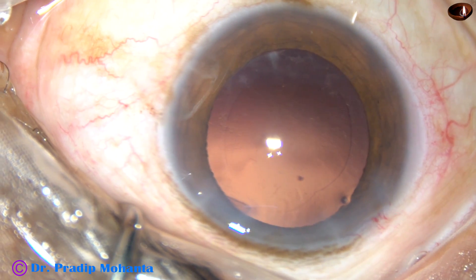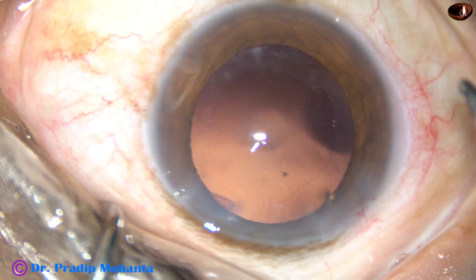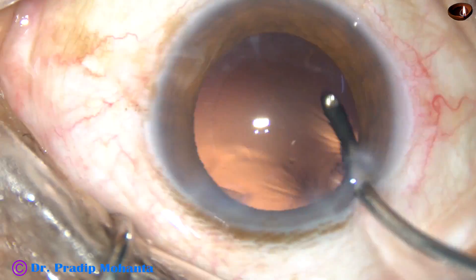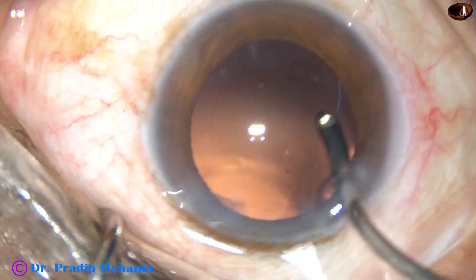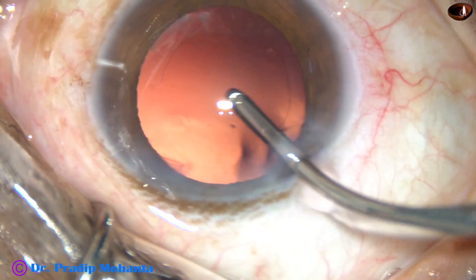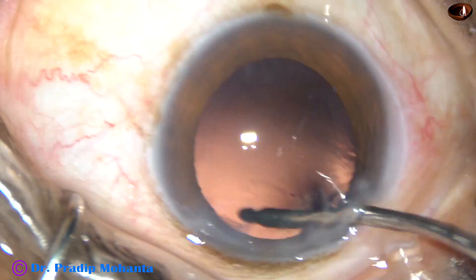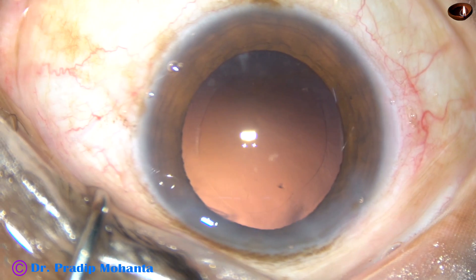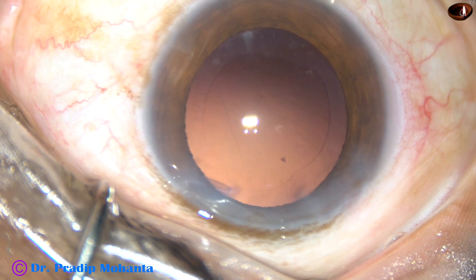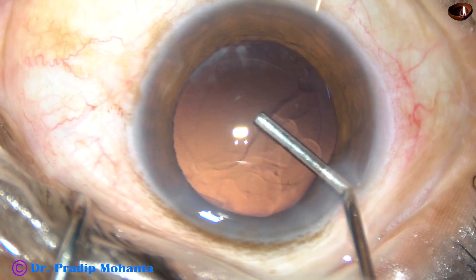A 23-gauge Simcoe cannula has been used. And now, before the foldable intraocular lens is implanted, this is what I call hydro polish. Use irrigating fluid and sweep it over the posterior capsule to clean it. Dislodge the lens epithelial cells from the posterior capsule and make it clean.